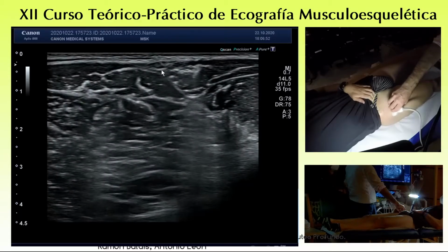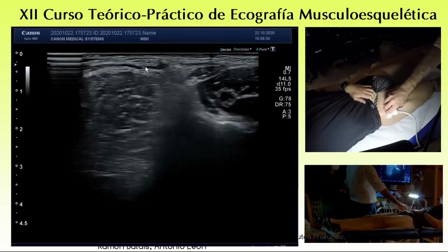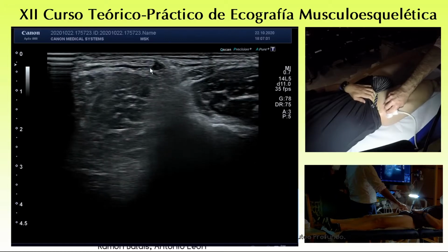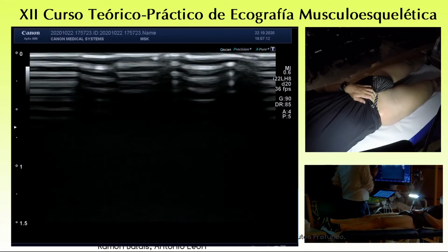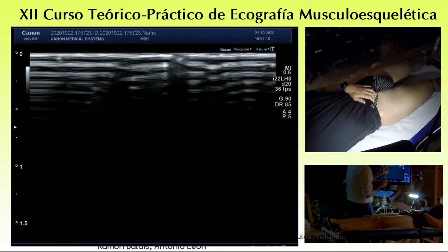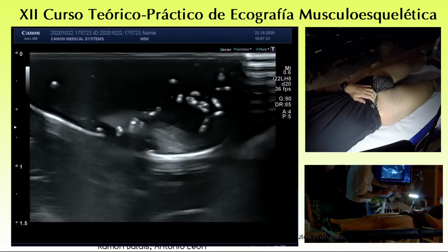And you see that there are some small fibers at this point, going up, in this case very close to the iliac spine. Just to be sure, if you have availability of a very high frequency probe, not necessarily this one, the 22 megahertz probe, but even a higher frequency probe, you can see the anatomy in this area even better.